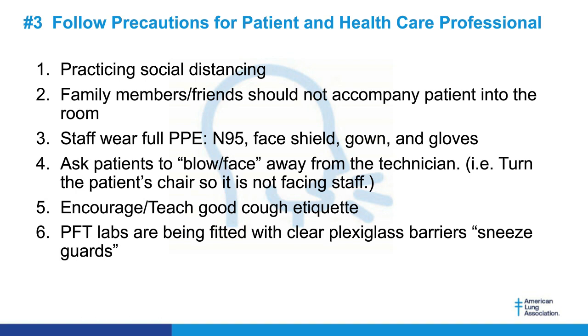We wear an N95. We've been wearing a surgical mask over our N95s to protect them because we use the same N95s all day. We use a face shield because spirometry induces cough. Probably the face shield is a really important thing. Gowns and gloves.